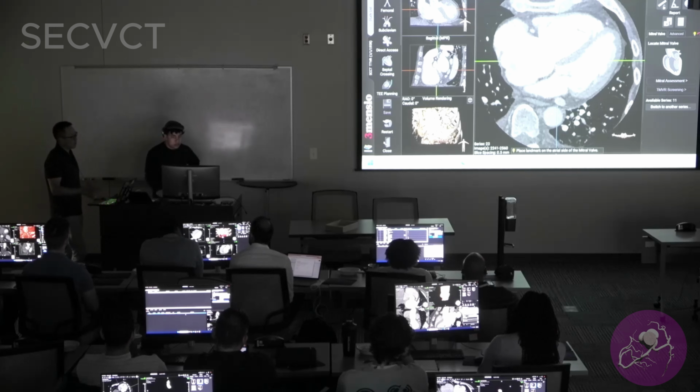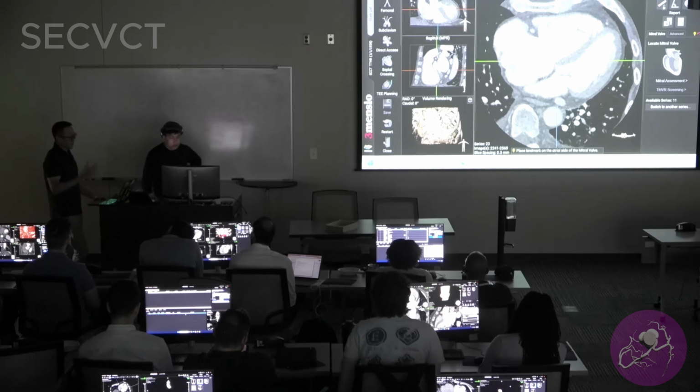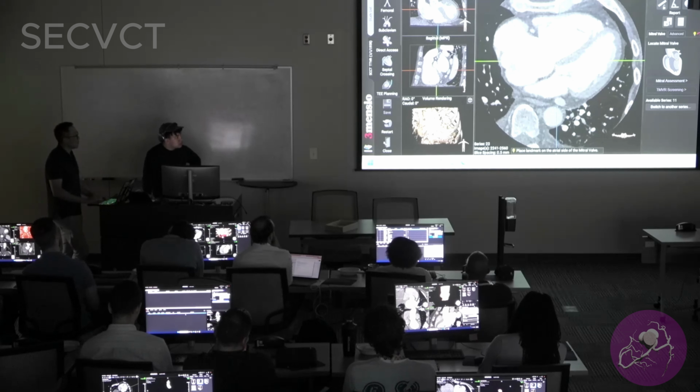The tricuspid and mitral stuff is kind of more of a niche area, and there's also a lot less in terms of national guidelines as to how to actually do these workups, and part of that is because there aren't that many commercially available valves in the tricuspid and mitral world. And so the vast majority of the valves that we do are in certain clinical trials, and so the workups all vary. There isn't one established pathway of doing these evaluations. So I'll show you more basic stuff today.